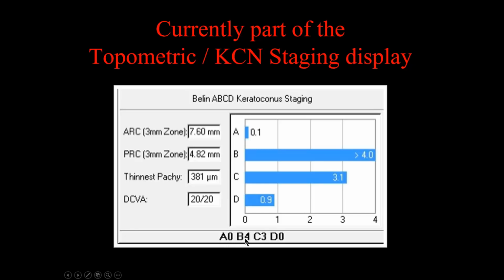The classification is shown here. Again, realize a classification by definition groups. So let's take weight: everyone who weighs between 180 and 200 pounds is in one group. That doesn't mean the person who's 181 and the person who's 199 are the same. It's just grouping. So this is the grouping.